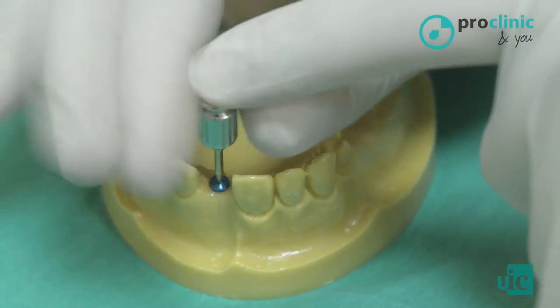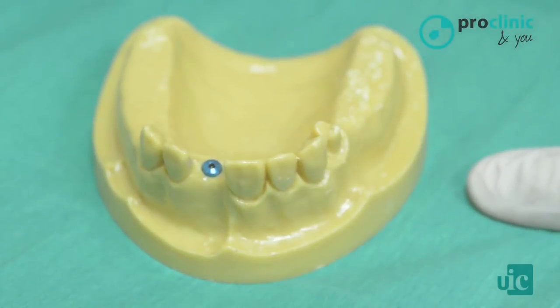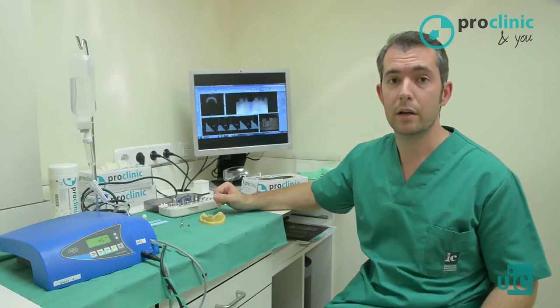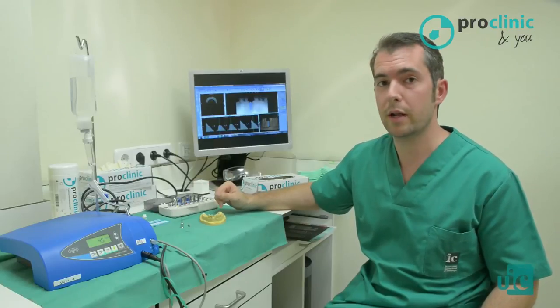If this surgery had been a real case, we would have had to wait a specific healing time period after the implant surgery in order to achieve bone integration, and later on, we would have proceeded with the prosthetics.